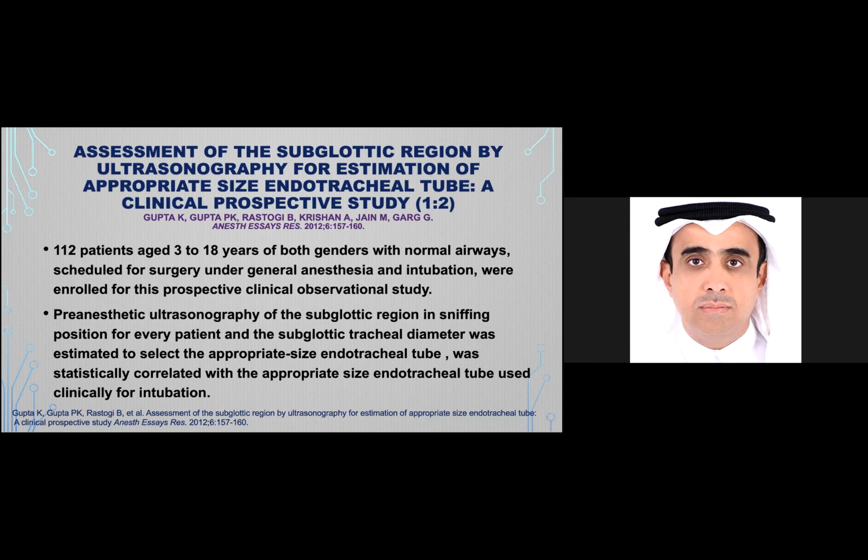Pre-anesthesia, we do ultrasound of the subglottic region in the sniffing position for each patient, to estimate the subglottic diameter and select the appropriate size of endotracheal tube. Then we compare this statistically with the clinical approach for intubation.